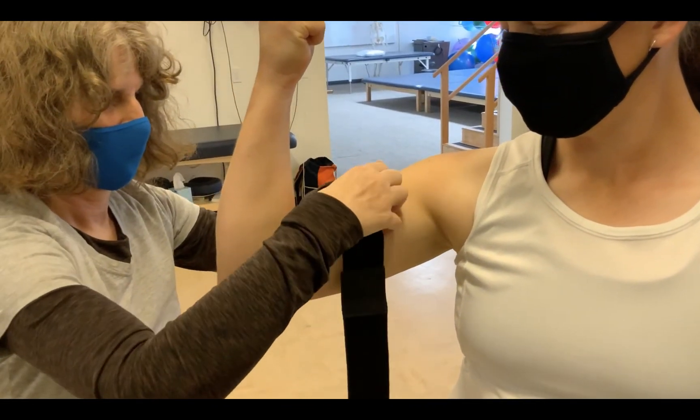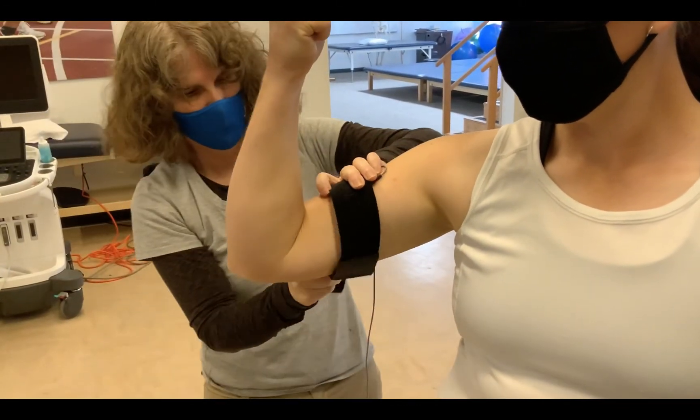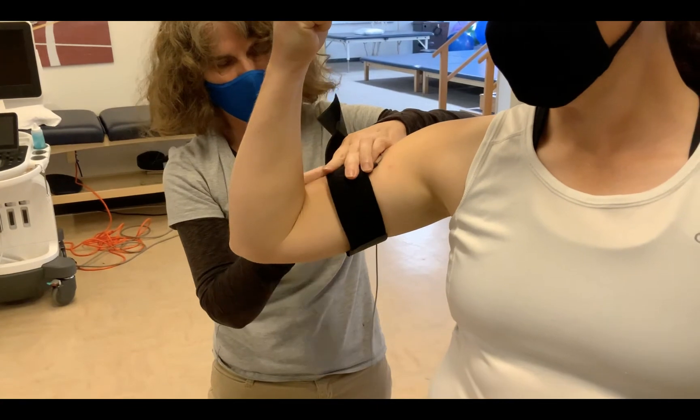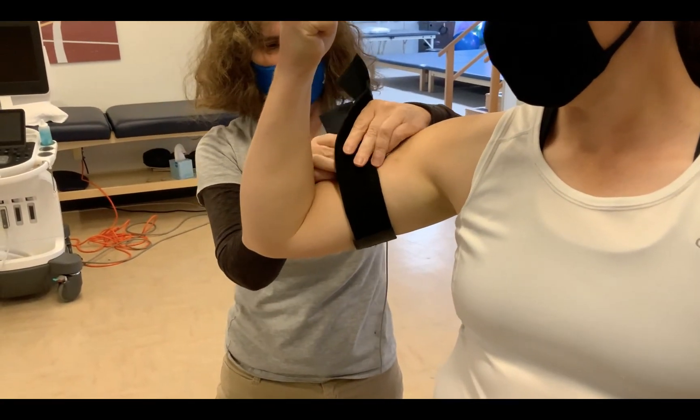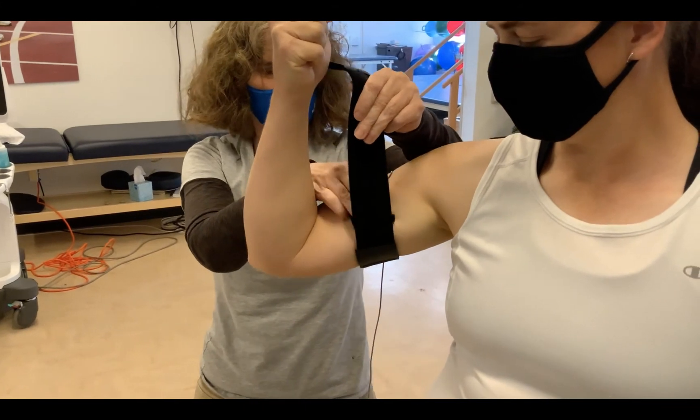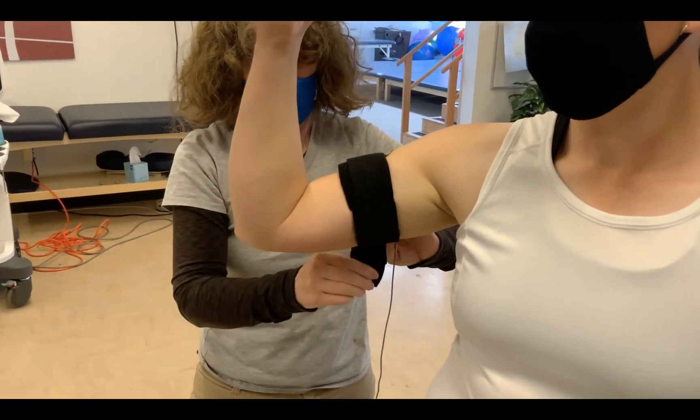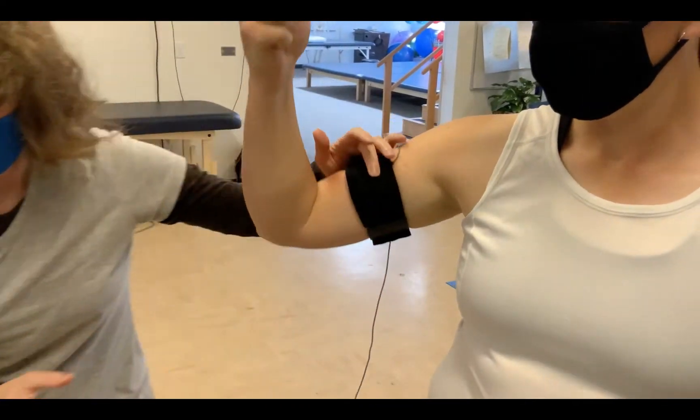Then you use some sort of strap or tape to wrap the sensor in place so that it stays no matter what you do. I'm making sure to keep clear of the cord and making sure that it doesn't interfere with the movement of the subject, so it should be very snug.